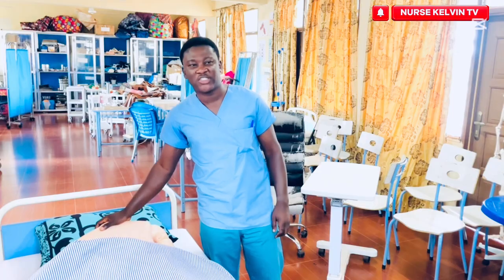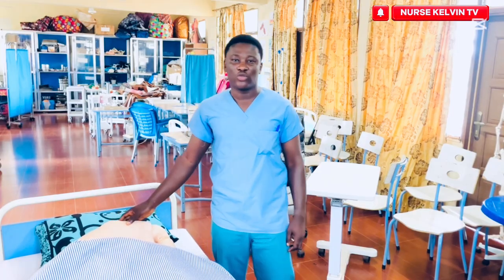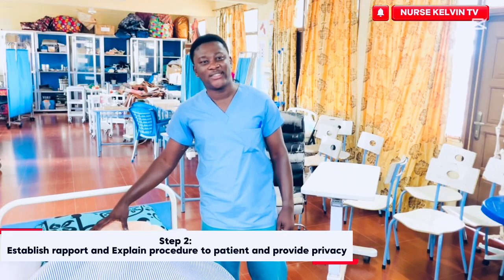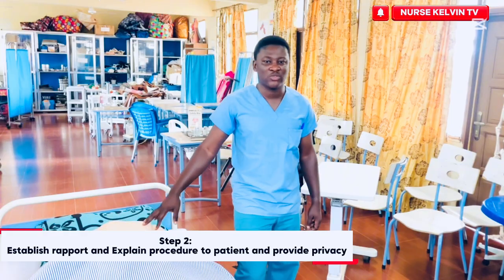So this is my patient, Mr. Kwame Amo. Yeah, we are using a dummy. So I need to first establish rapport with Mr. Kwame Amo, then explain my procedure to the patient. Stick and stay with me and let's go.